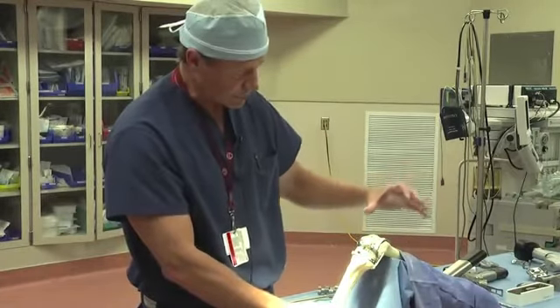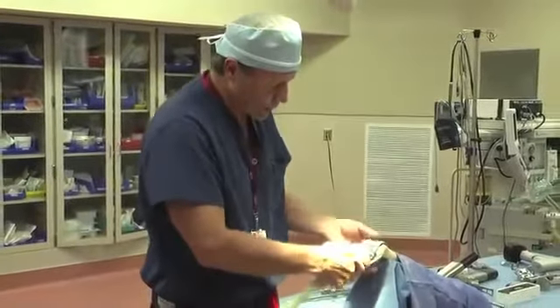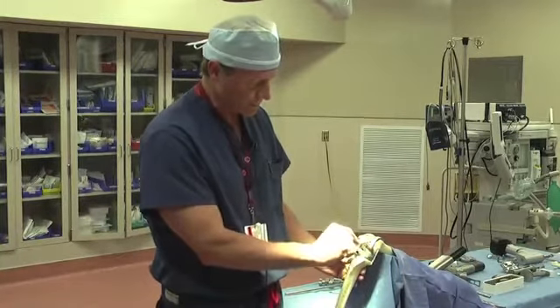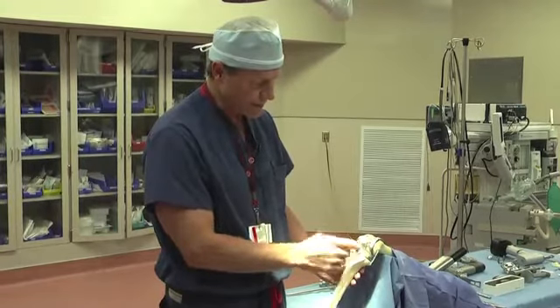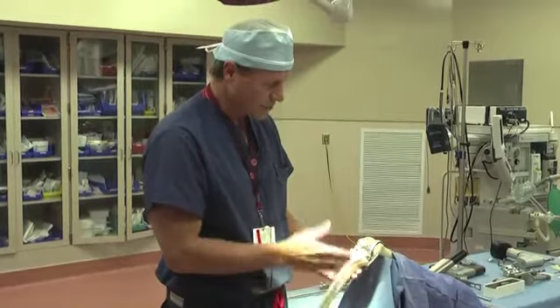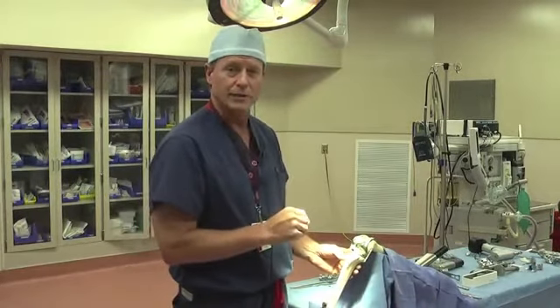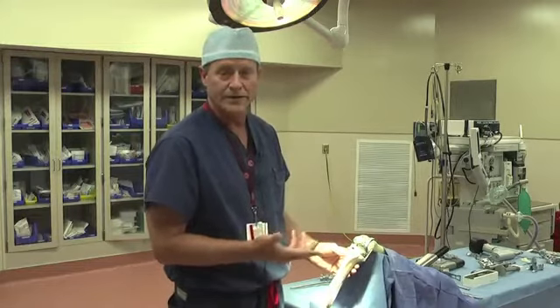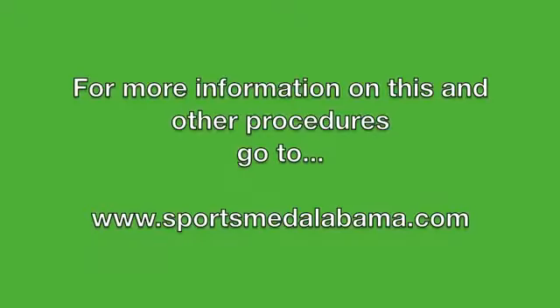We'll drop the kneecap back into place, take our retractors out, and put this knee through a range of motion — make sure we can get it fully straight and fully bent. We want to check the stability of the knee, make sure it's all stable and within the constraints of the ligament. We have the ability to pop this component out and go with a thicker piece. Once we figure that out, we know the size of our femoral component, our tibial component, the polyethylene that goes in between, and our plastic button for the patella. At that stage we'll remove all the trials, open the final implants, wash off the bony surfaces, and cement those components on. The cement takes about five minutes to harden, then we close up the wound. This operation takes about an hour to an hour and fifteen minutes. That's basically how the total knee replacement is done with the dry bones model. For more information on this and other procedures, go to www.sportsmedalabama.com.